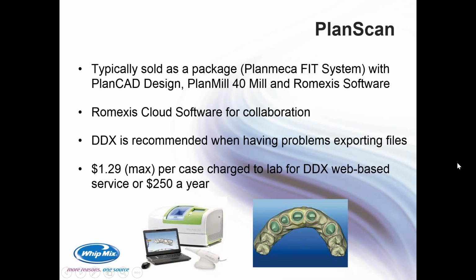The Planscan from E4D is typically sold as a package. They call it the Planmeca FIT system. It's sold with the Planmeca CAD design, the Planmill 40, and then Romexis software. So it is meant for in-office scanning, designing, and milling, although it is an open STL. And then Romexis really is their cloud software for collaboration with third parties.